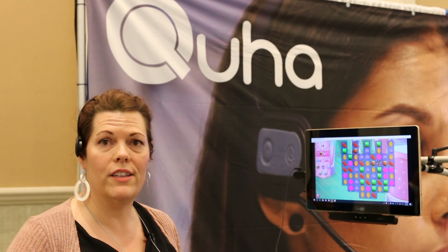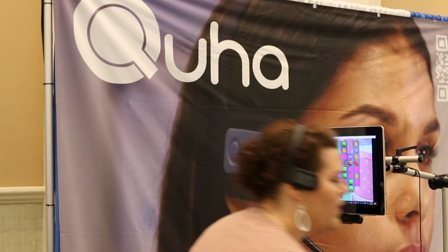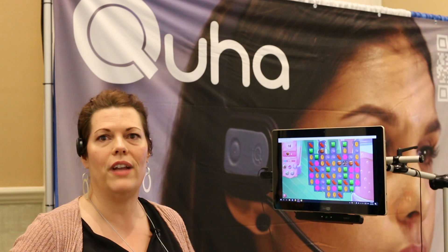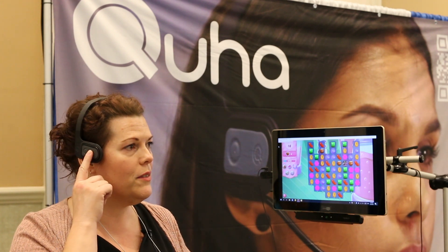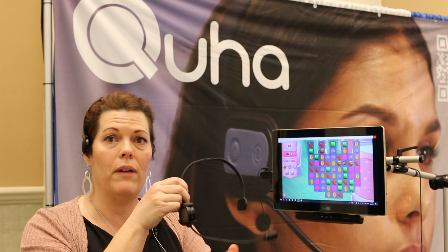There are a few ways that you can wear it. I'm wearing the most standard headband, which the unit just slides right into. There's also a contactless puff switch option for people who need to hold it up.